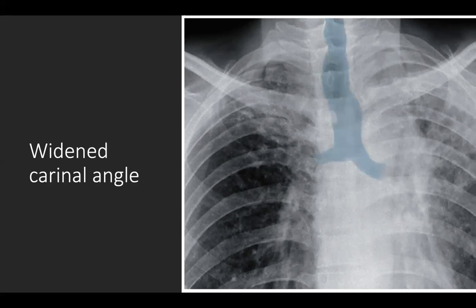The carinal angle is the angle between the left and right main stem bronchus. Normally, the angle is between 40 and 100 degrees. An increase in the carinal angle is an indirect sign of pathology in the heart, mediastinum, or lungs. If there is increased carinal angle, something is pushing from beneath the carina or pulling from above the right or left main stem bronchus.